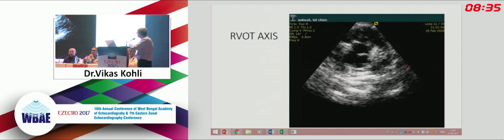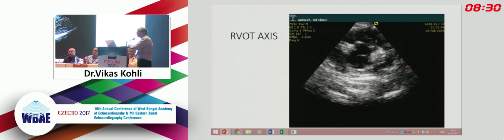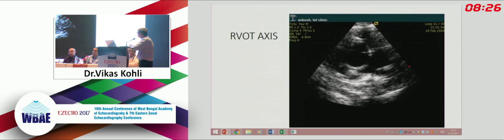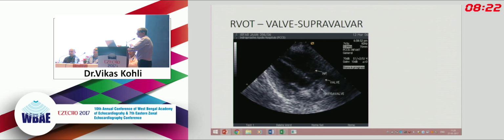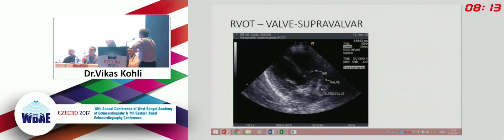So just a word about that whitish area is where usually the valve is tethered. There is tethering of the valve, and the surgeon might need to release the valve leaflets from that particular point of tethering. So you could mention that to the surgeon, but keeping the time constraints in mind, we are trying to move ahead. So you want to describe this view here?